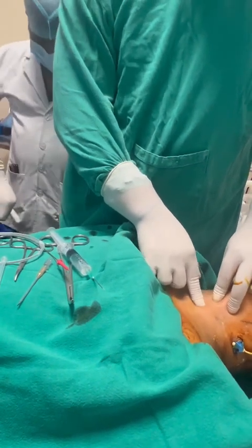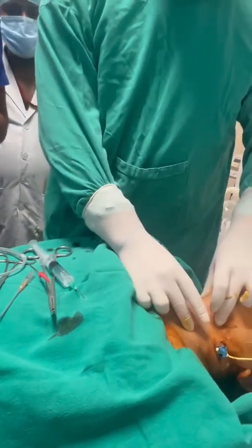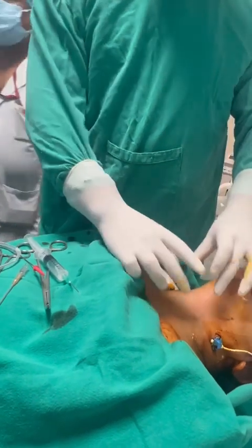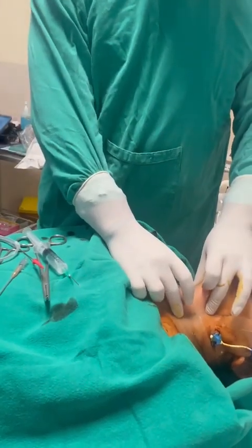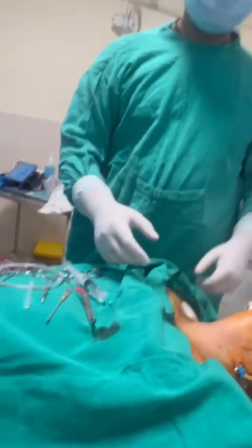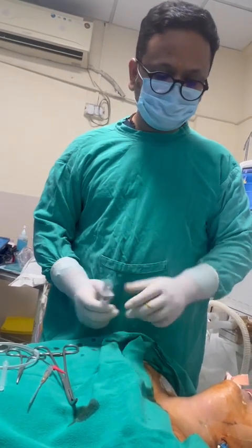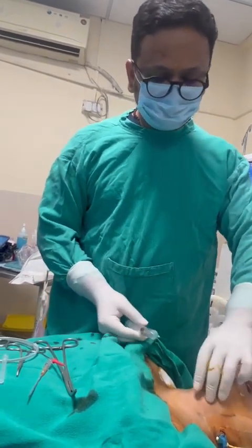This is your thyroid gland, which is overlying the cricoid cartilage. So you have congestion of the anatomical structures, which means all the anatomical structures are overly packed into a small space. So you will not have the freedom to move around. So they are generally difficult. But first, what do you do?